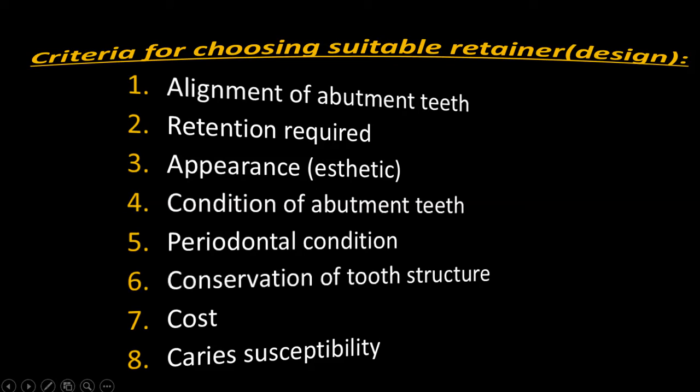طبعا راح نشرحها بالديتيل: alignment, retention required, appearance of the teeth, the condition of abutment, periodontal condition, conservation of tooth structure, caries susceptibility.